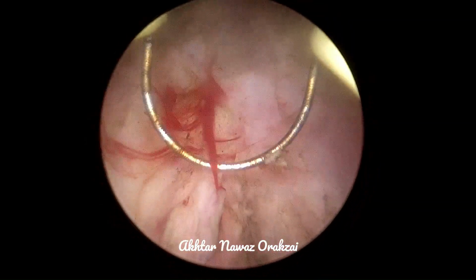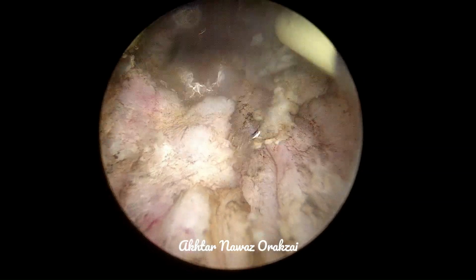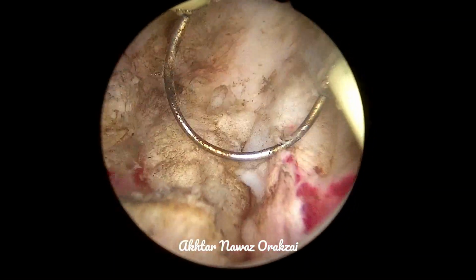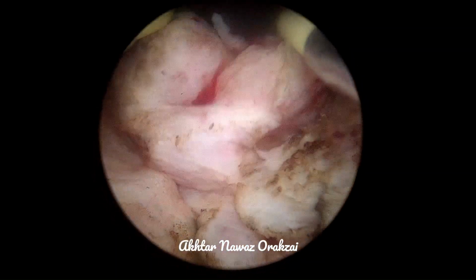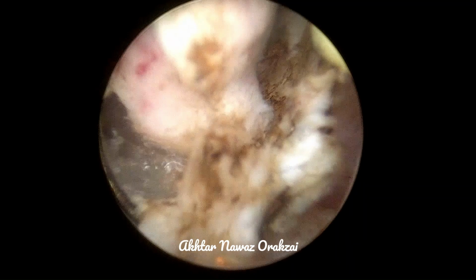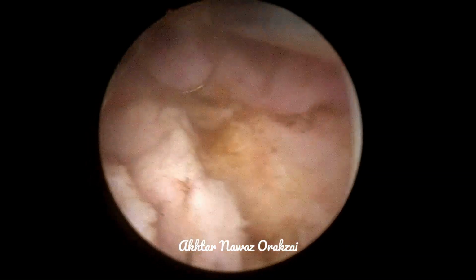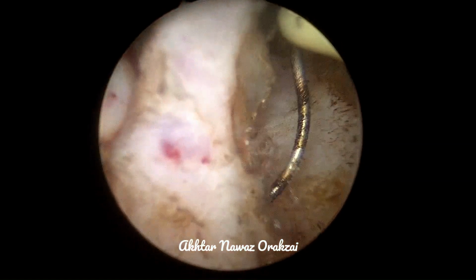However, I'm trying not to fiddle anymore with that area of the capsular breach, because the more you try to tackle it, the more problematic it becomes, widening the breach and increasing its size. The size is increased, the depth is increased, and bigger vessels are opened. So one needs to be really careful. So more of the median lobe is coming up.